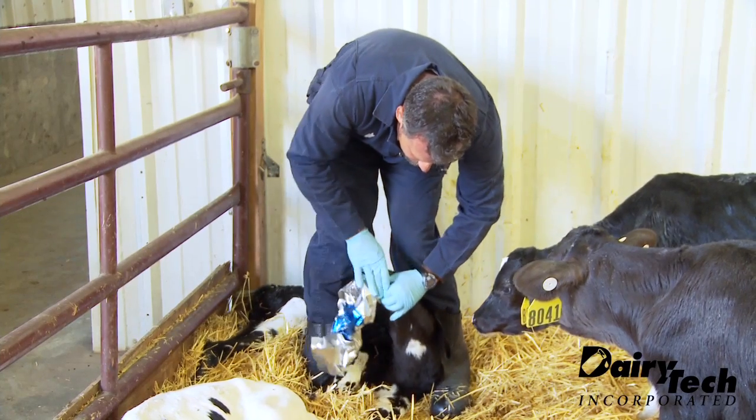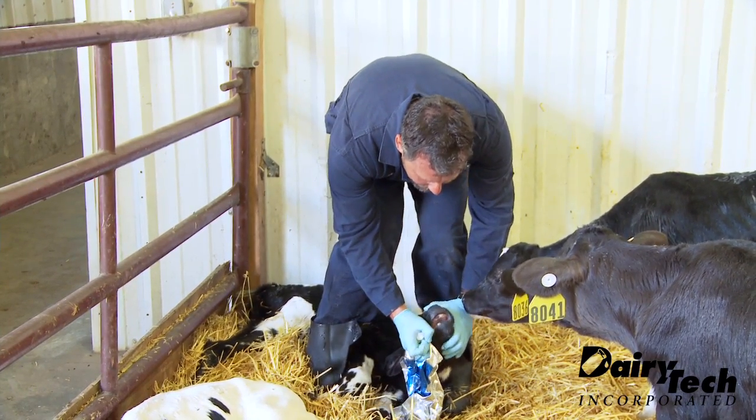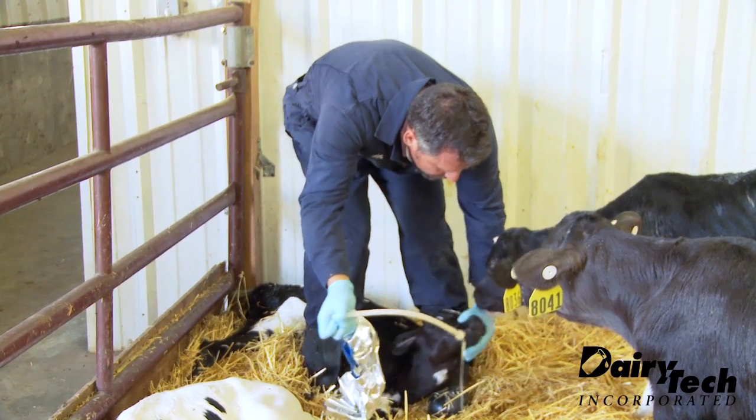So now when I'm finished, I'll simply kink off the tube again, lower the bag, and just gently withdraw the tube.